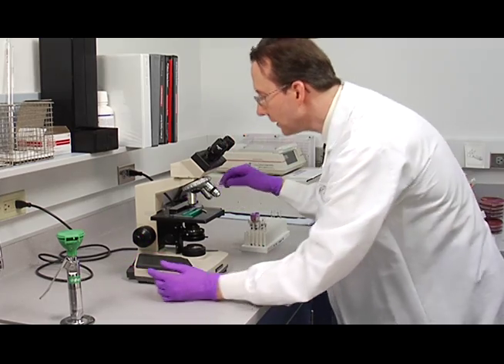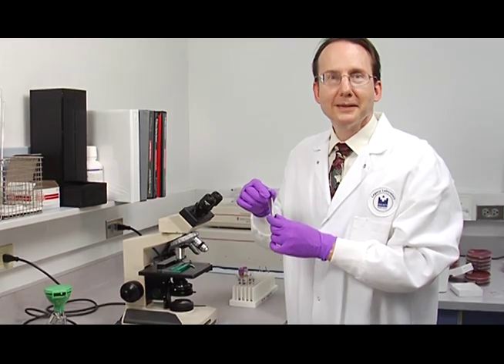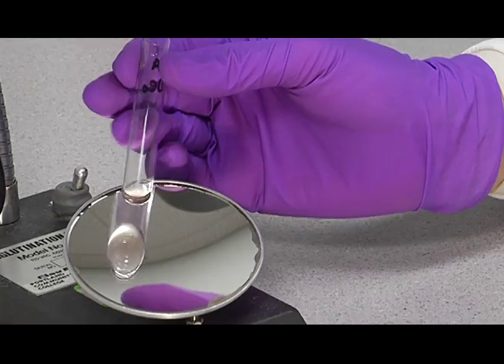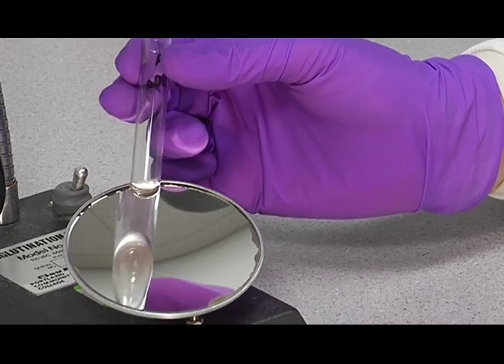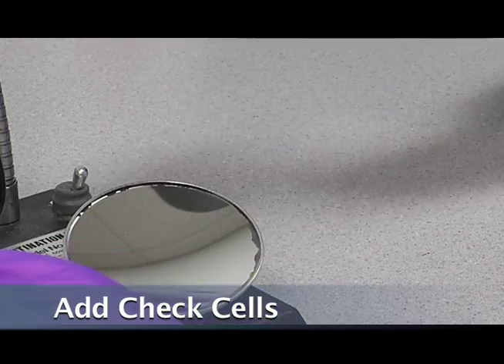And having confirmed the negative results on the D control, then report those results on your result sheet. Now to prove that this is a true negative, we need to add check cells. And that's the next step.